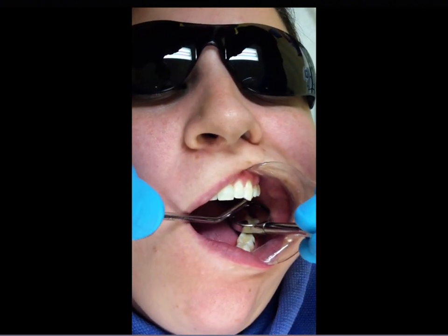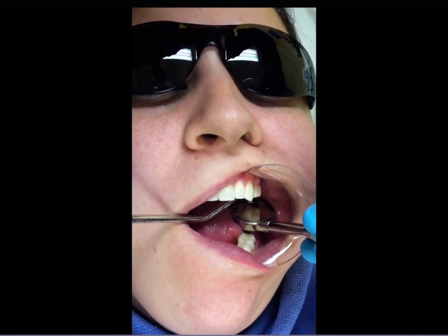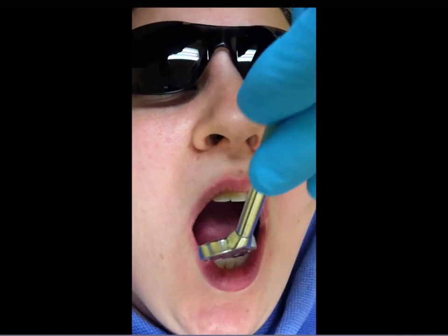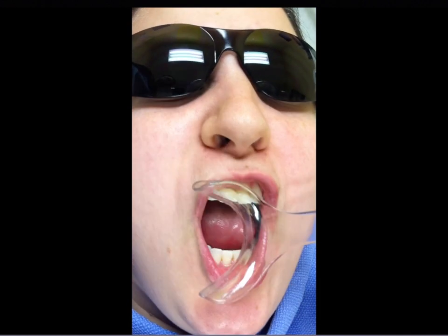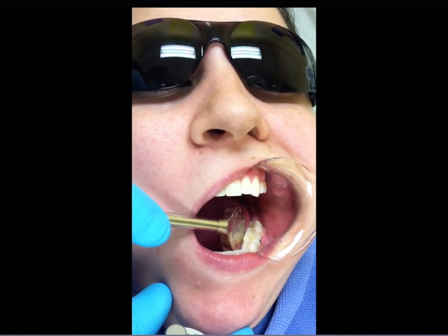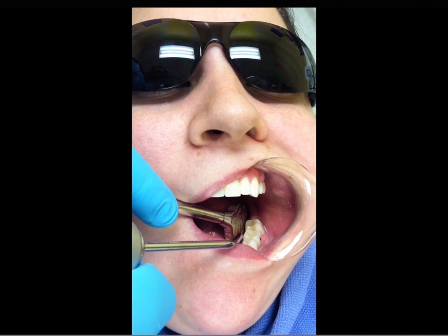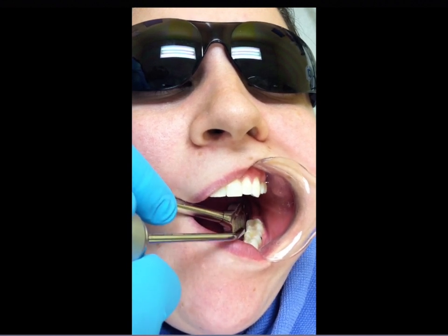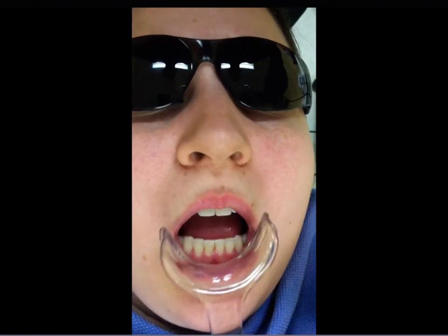I don't personally use these cheek retractors with patients, but watching these videos it's probably a decent way to do sealants in the lower left and lower right — use a suction mirror to retract the tongue and have the patient hold their cheek back while you're placing the sealant. There are times with some patients where their cheek gets into the tooth and contaminates it when you're trying to place the sealant.